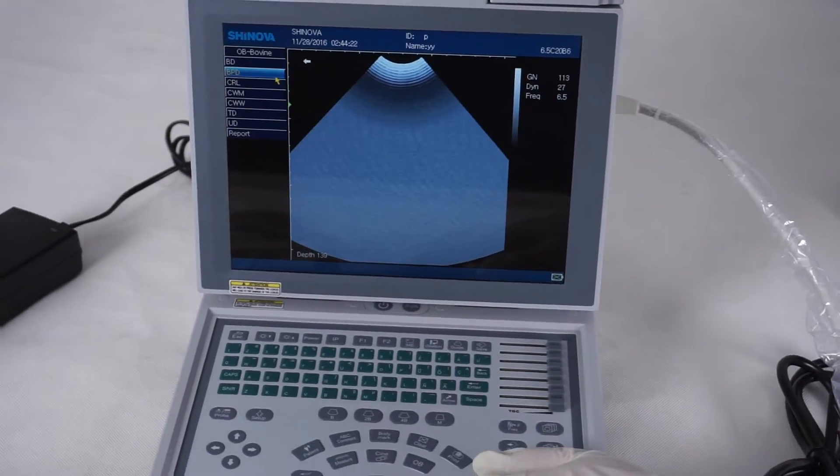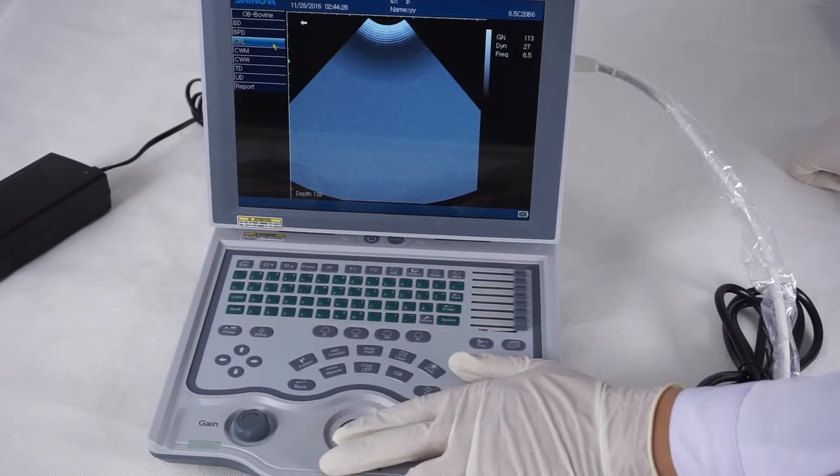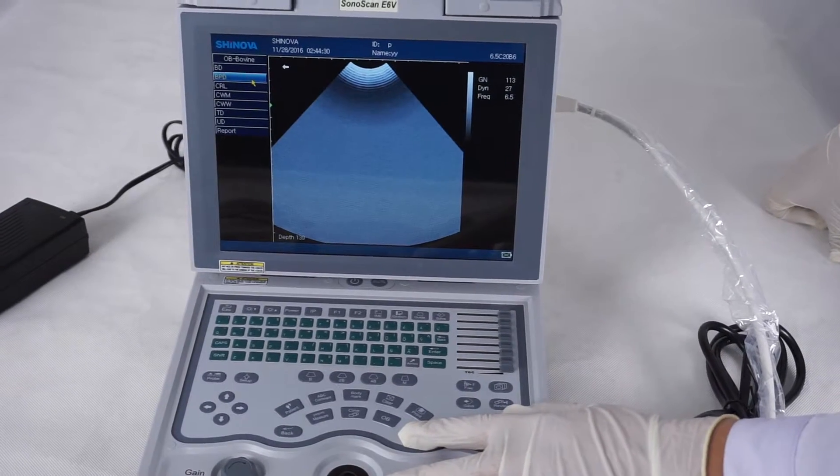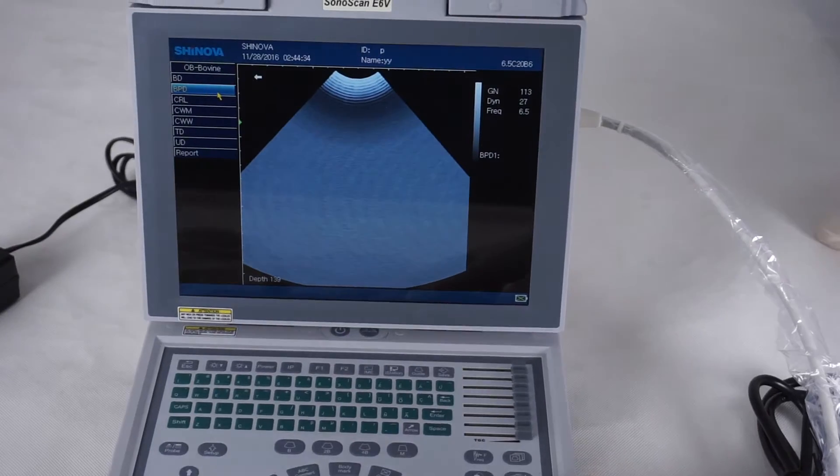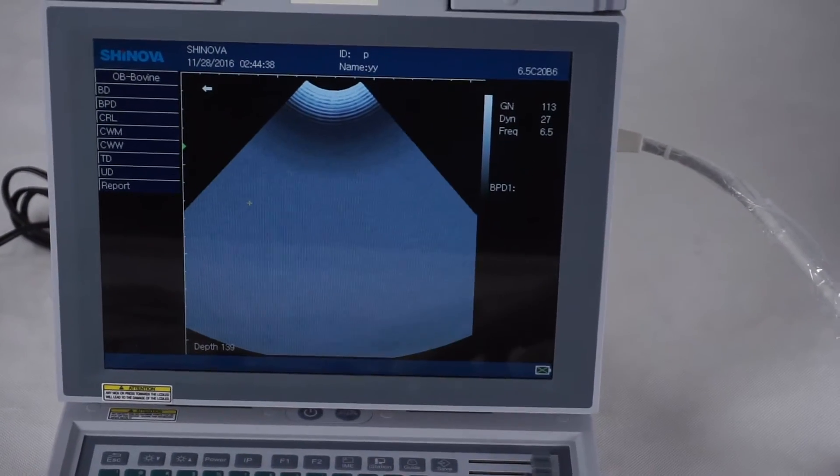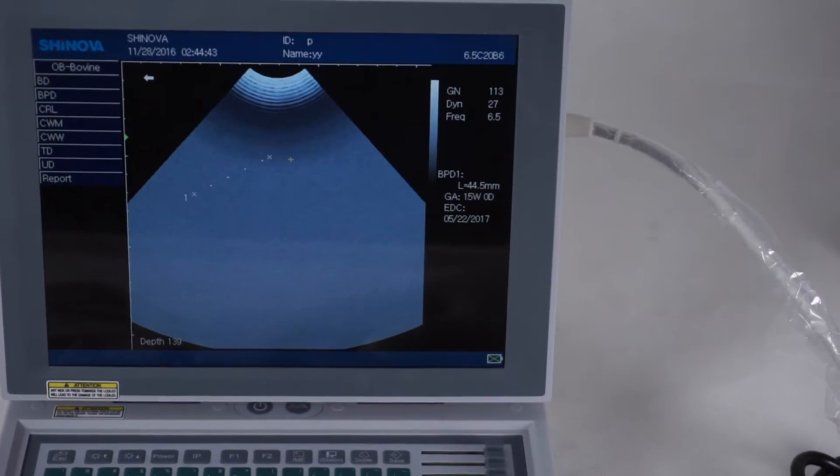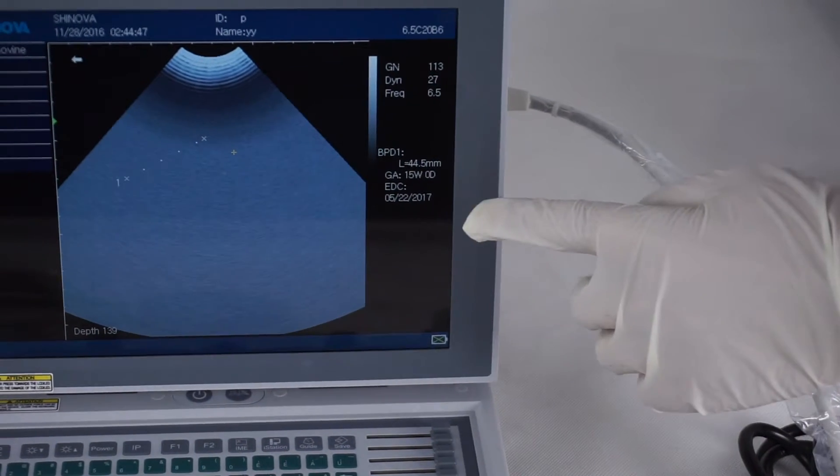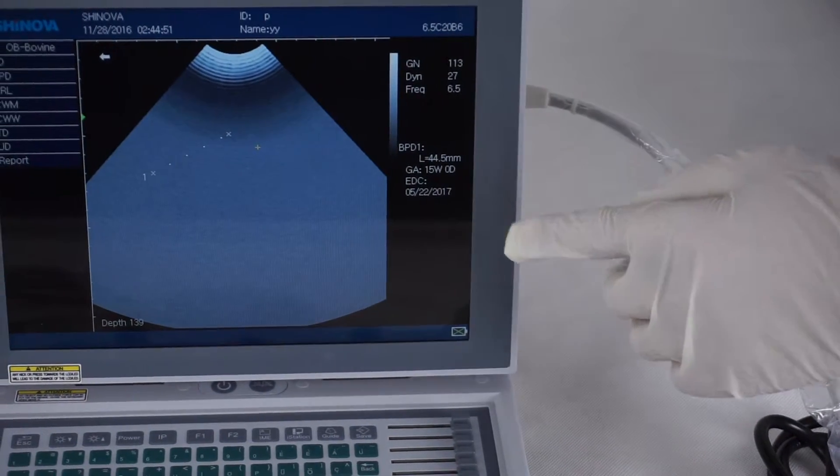And we take the test, make the test for BPD. When you set the distance, you can see the data on the right side: GA and EDC.